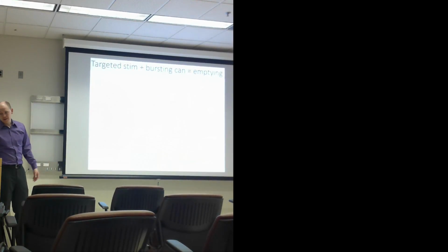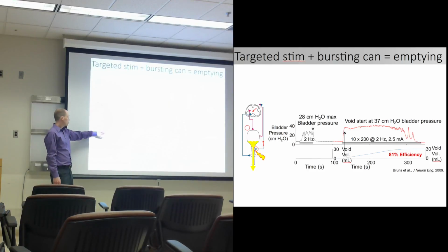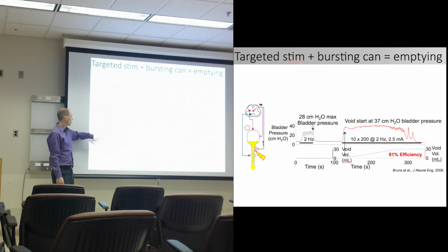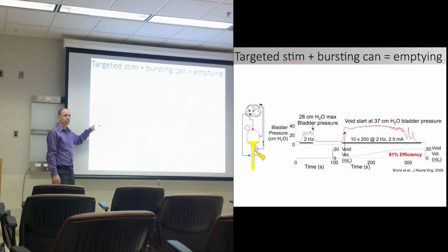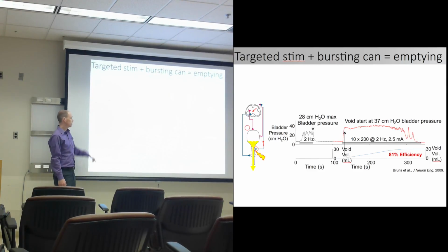ultimately, our goal is to empty out the bladder. So, the third series of experiments is where I placed fine wires into the wall of the urethra, and my goal was to target the proximal circuit to empty the bladder out with the stimulation, and not also drive local current spread towards the sphincter. So I tried to place them in a way to drive reflex circuits and not close off the outlet pathway.